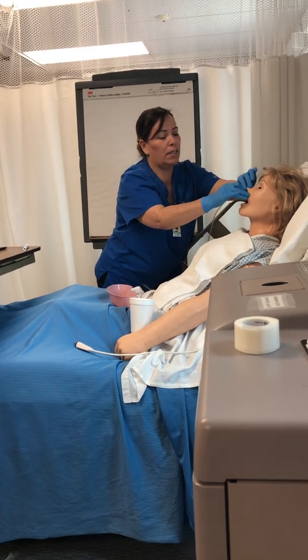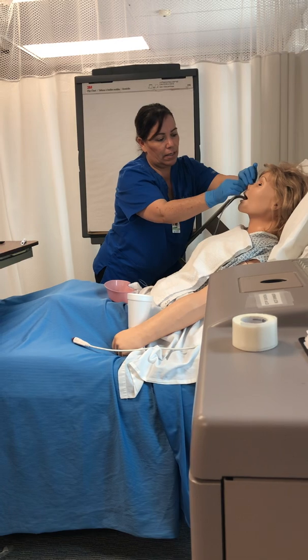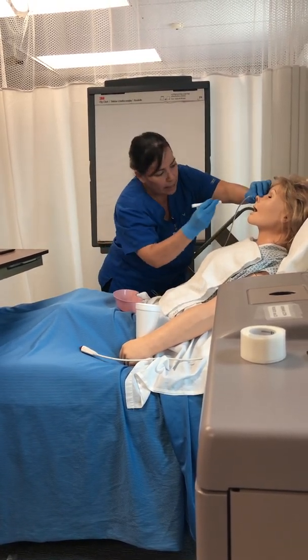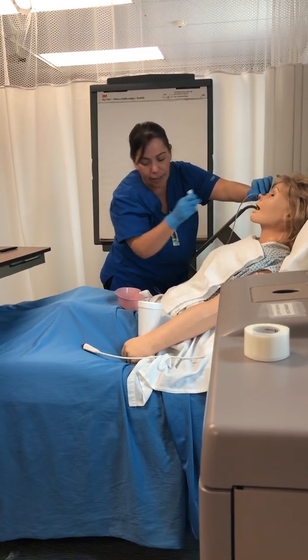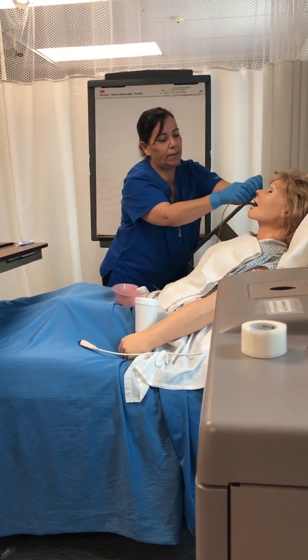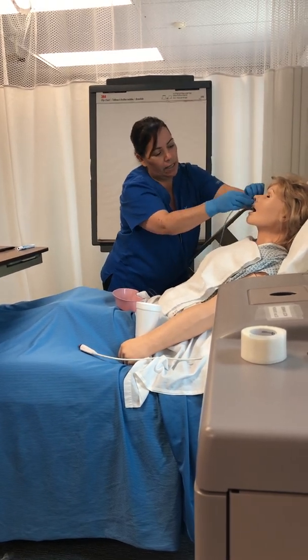While you're doing this, instruct the patient to drink water. Drink water and swallow it, and then you check with your penlight the back of the throat for kinks. Okay, so there's no kinks. So we're good. You instruct the patient to drink more water and swallow it, so we advance more. And while you're doing this, you put the head down to the chest. Okay, there you go.